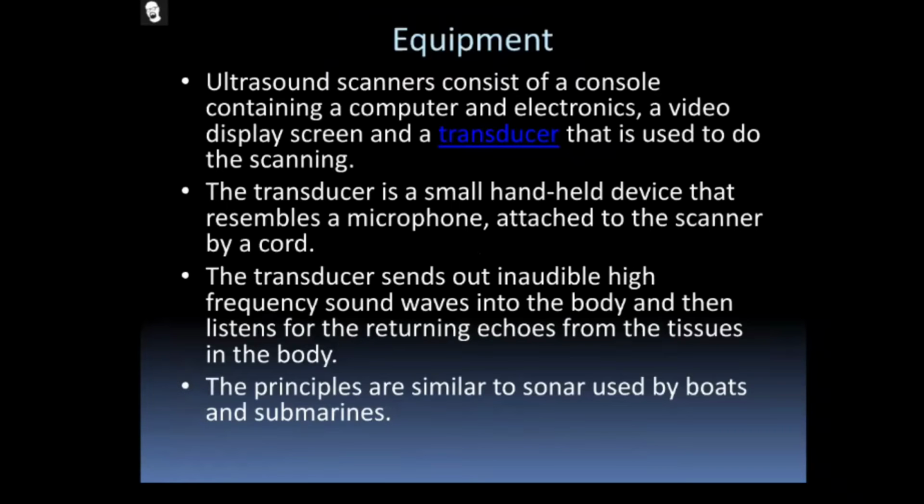Through this ultrasound machine, we can aim not only at fetal purposes. For example, if a person met with an accident and because of the injury has metal implants, and the patient has any malfunction or requires scanning, the doctor does not suggest X-ray, CT, or MRI because of the implanted devices in the internal organs. For that kind of person, the only suggestion is ultrasound, to see what happened inside the internal organs.